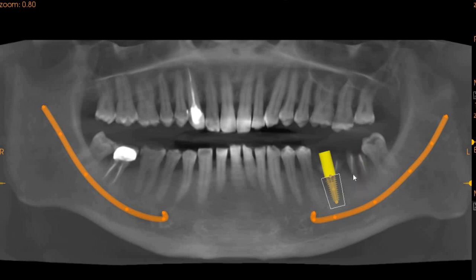Now, these two implants have been placed for our kind doctor. The ideal implant placement location, according to our CBCT, is going to be on the sixth region. It is going to be a 4.5, 4.9, which is 5 millimeters, and 11.5 in length, whereas in the 7 or the distal region, we can place again a 4.9 and a 10 millimeter implant.